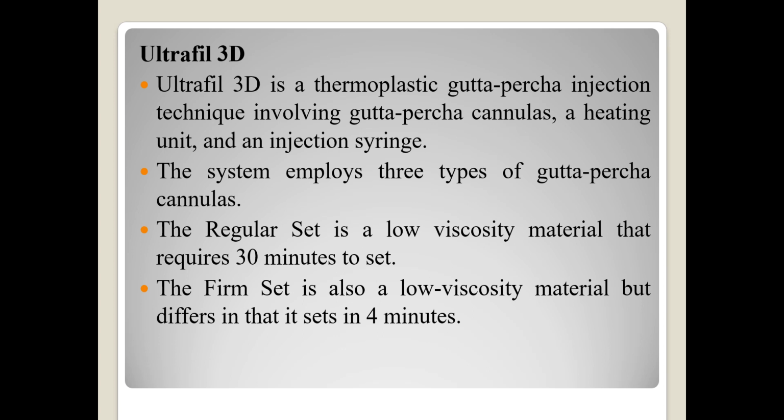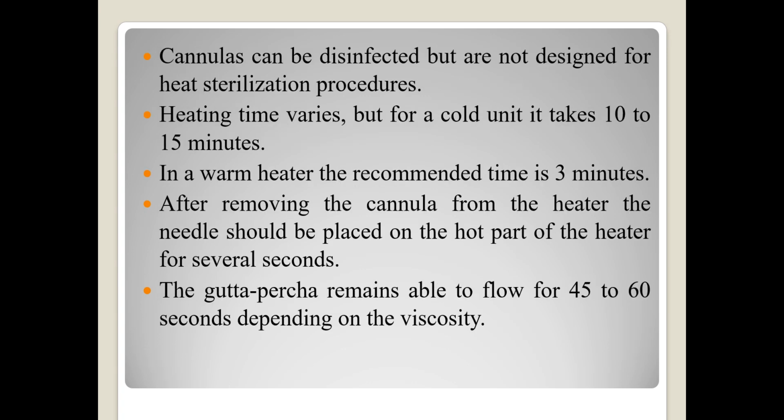Ultrafil 3D is a thermoplasticized gutta-percha injection technique which involves the gutta-percha cannula, a heating unit and an injection syringe. The system employs 3 types of gutta-percha cannulas. The regular set is a low viscosity material that requires 30 minutes to set. The firm set is also a low viscosity material that differs in that it sets in 4 minutes. Cannulas can be disinfected but are not designed for heat sterilization procedures.